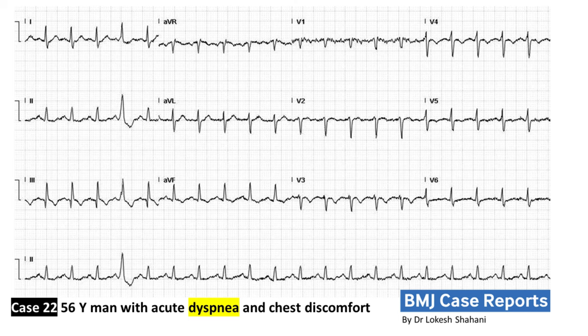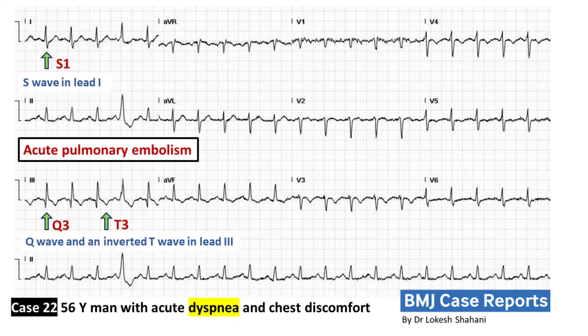Case 22: The patient is a 56-year-old man with acute dyspnea and chest discomfort. The ECG shows sinus tachycardia, an S-wave in lead 1, Q-wave and an inverted T-wave in lead 3. This phenomenon of S1Q3T3 is suggestive of acute pulmonary embolism.